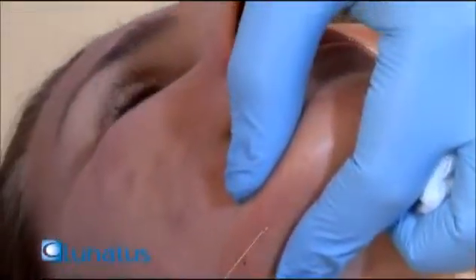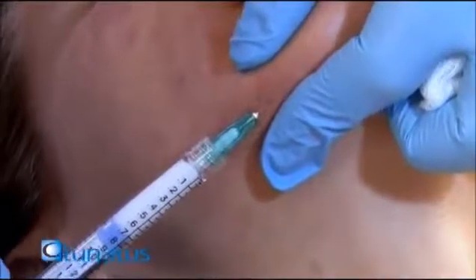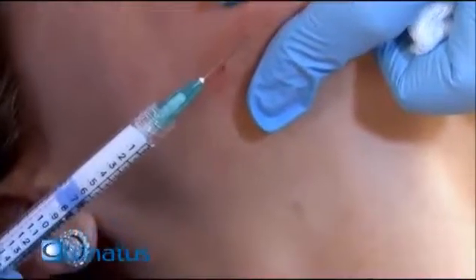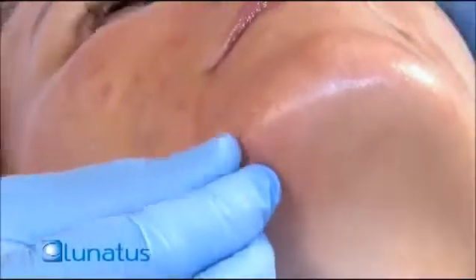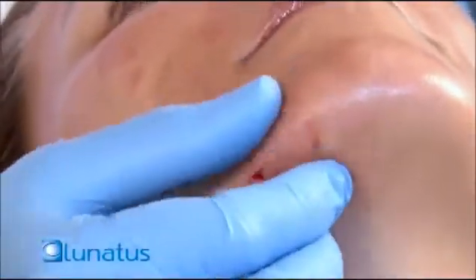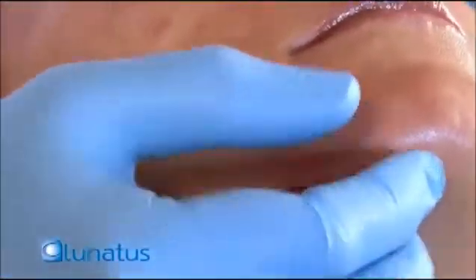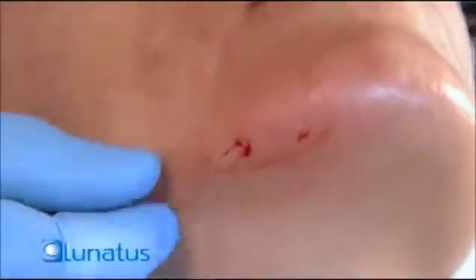Same thing on this side — quite deep. Massage is always going to be key in this section. This change might not be significant on camera, but for the patient who sees herself every day — especially someone like Roberta who is quite astute and picky about the way she looks — she's definitely going to notice the difference between the two sides.